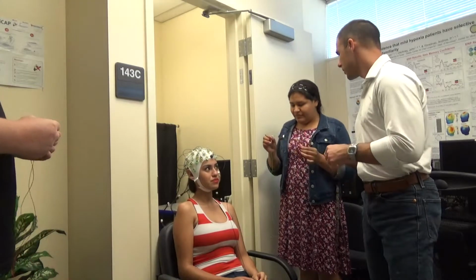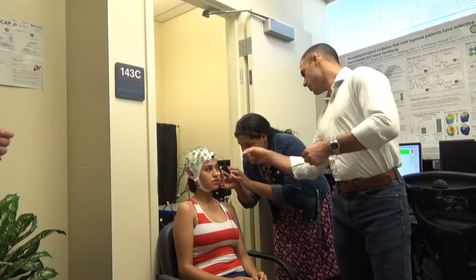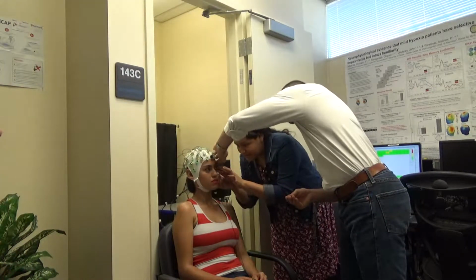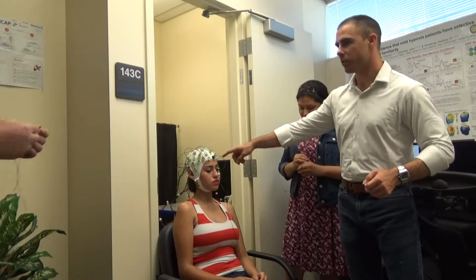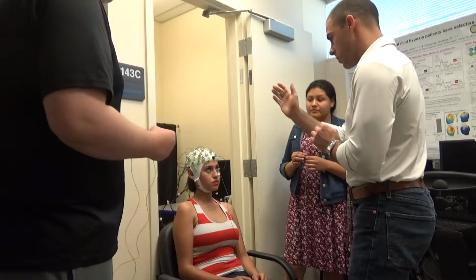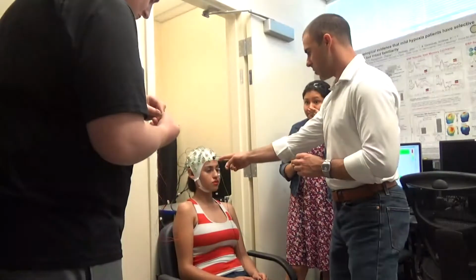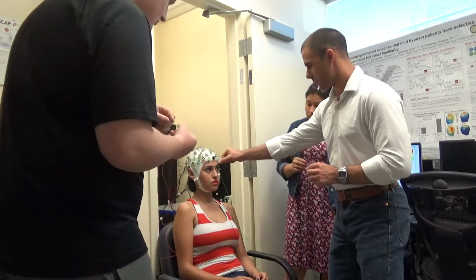Fine. So you're going to put that one on the horizontal, kind of right about there. You might even sneak a little edge in underneath there. Yeah, perfect. Okay. And Ryan, you're going to put the other one right above? So what you want to do is kick me out of position where I'm standing here and stand right center line with her, and you want this, again, right in line with her pupil and right above the lower one. So you want to put it right about there.